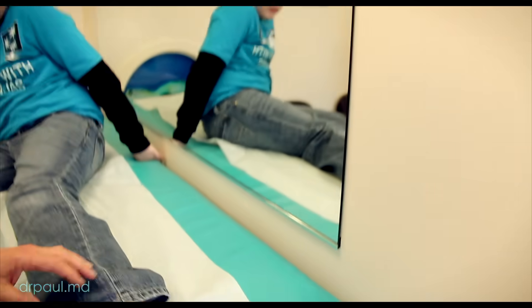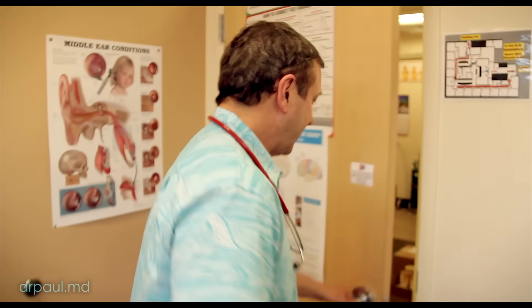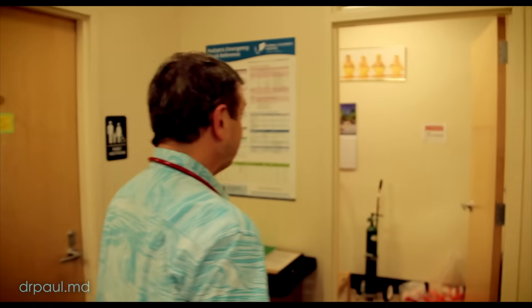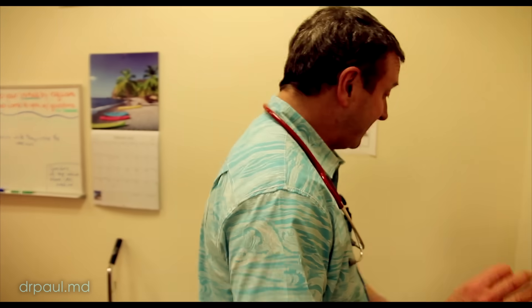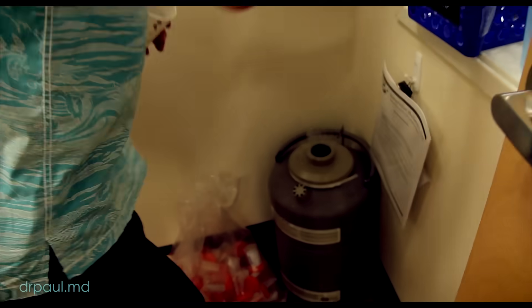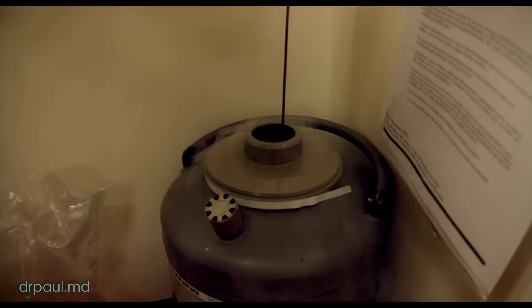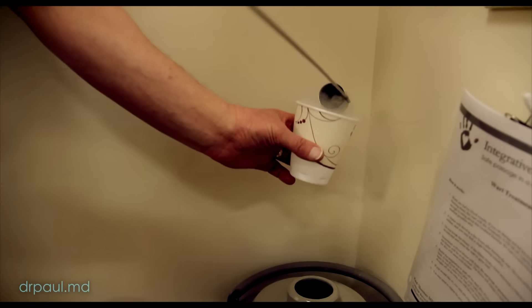Alright, let's see if that Emla has done anything. That is looking good — it's really hard to tell until I wipe it off. We're going to go get our liquid nitrogen and then come back and freeze it. Liquid nitrogen is stored in a special container because it is so close to the vapor point that it will evaporate. The only use for styrofoam in the world is to put liquid nitrogen in it — otherwise this stuff should be banned. So this is our container; we've got our little ladle and we just go down into the liquid nitrogen and come up with it and pour it into our container.